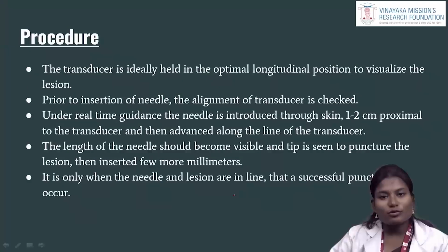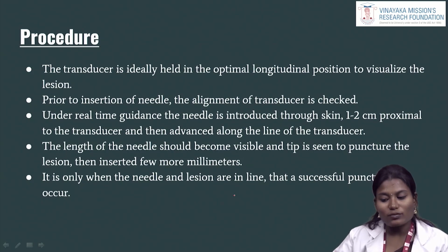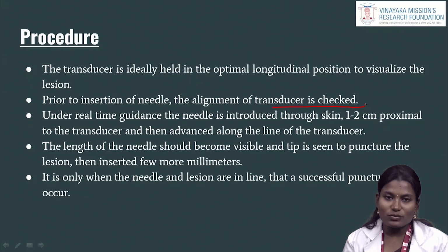Here is the procedure for ultrasound-guided FNAC technique. The transducer is ideally held in the optimal longitudinal position. The patient should be positioned so that the lesion can be visualized comfortably. Prior to inserting the needle, the alignment of the transducer is checked. We have to check the site of the puncture area using the ultrasound.